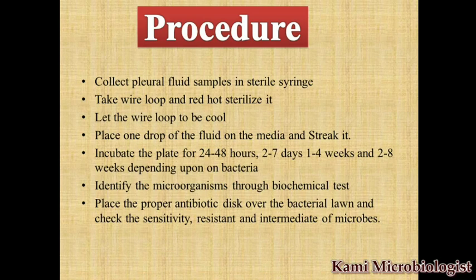Then after that, what will you do? You have to place the proper antibiotic according to the bacteria, which we will explain in the next slide, and it will give you the sensitivity report or resistant and intermediate report of the microbes. Then after that, you will report the test.